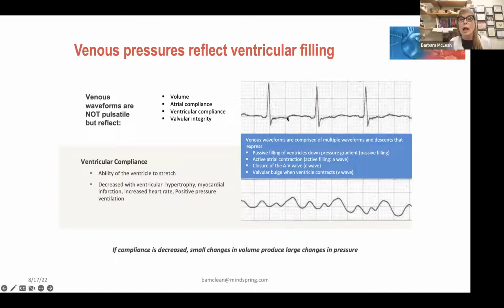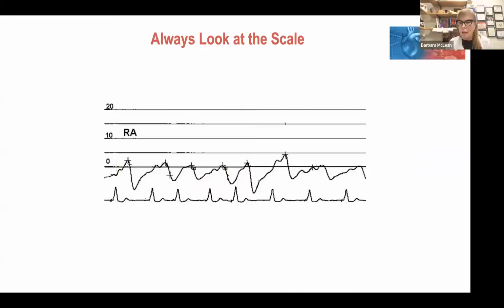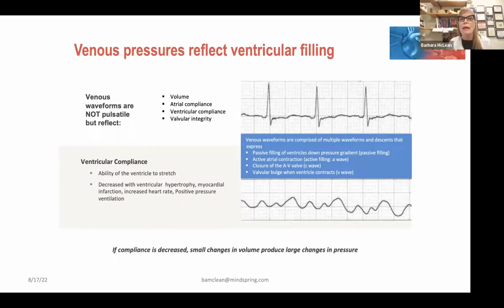I'm going to draw a line down from my T wave, about midpoint of the T wave, straight down. That's your V wave. Here's your A wave, here's your V wave. So what came in between was your C wave. Okay, it's pretty straightforward. Here's the problem.